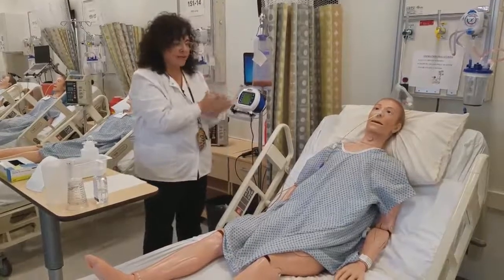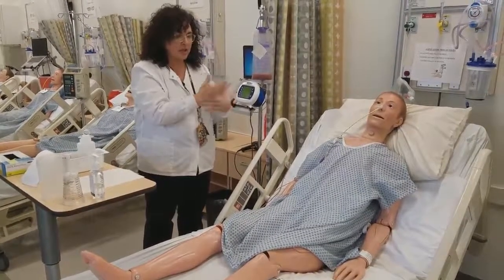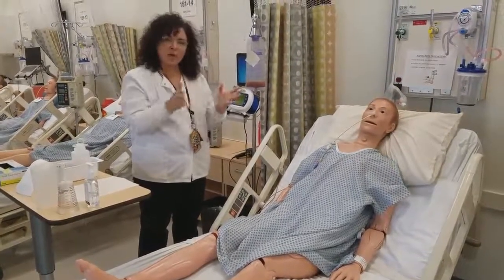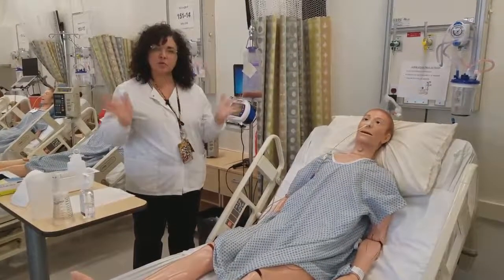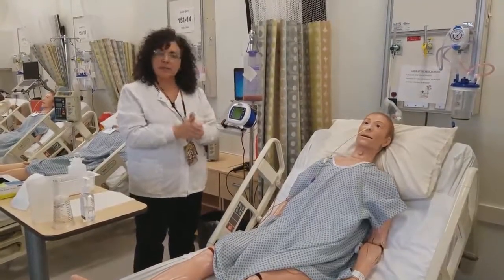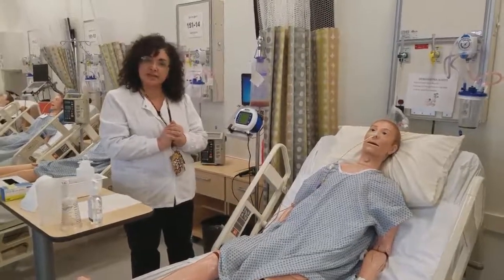Every 4 hours I need to check GRV in order to assess tube feeding tolerance along with other parameters for tolerance. And in this hour, he is due for his GRV to be checked, but he is also due for some meds. So I'm going to coordinate those two together. So I will begin by going to the med room and getting the medications that he needs.